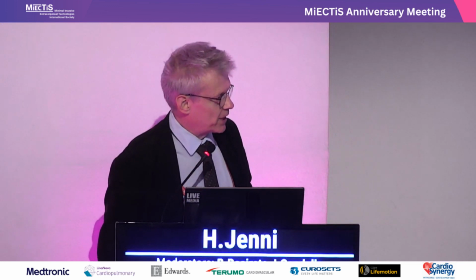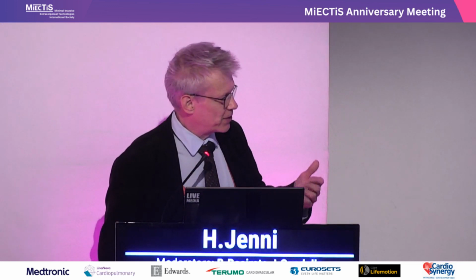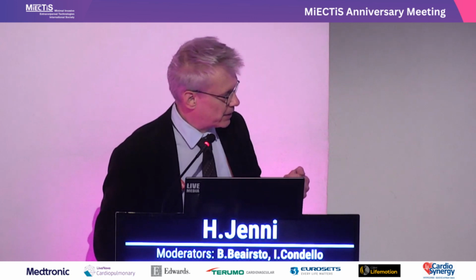And for CABG, for example, there's no reason, as there's such a low volume of suction blood. We just use cell saving for CABG. We never get suction blood back into the system for CABG. But the story during open heart surgery is completely different. Then you have to deal with much more blood. And vent blood, as I say, is quite good blood because it was not in contact with air for a long time and is less activated than the pericardial shed blood. That makes sense then to separate them.